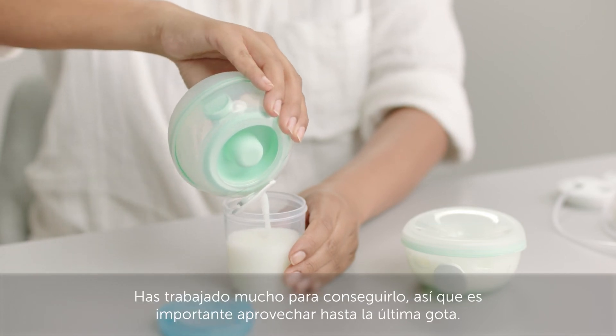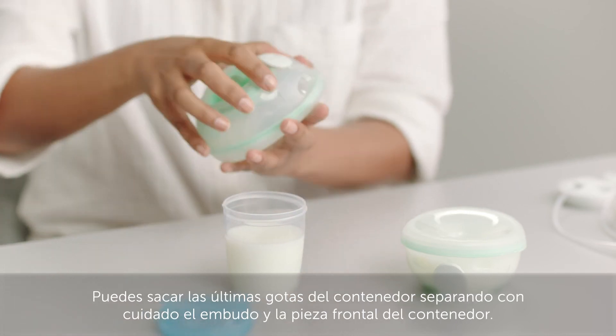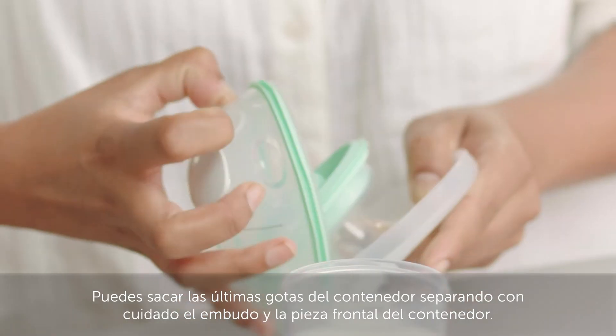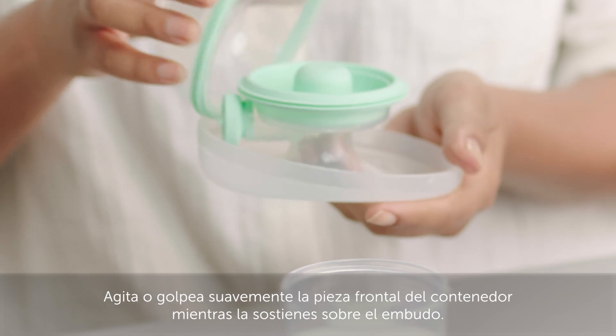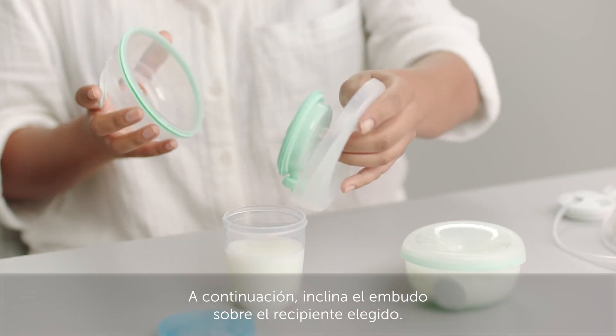You've worked hard to make it, so it's important to get every last drop. You can get any final drops out of the cup by carefully pulling apart the breast shield and cup front. Gently shake or tap the cup front while holding it over the breast shield, then tilt the breast shield above your chosen container.